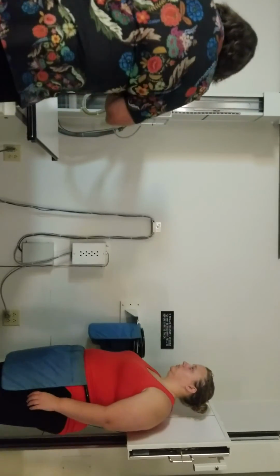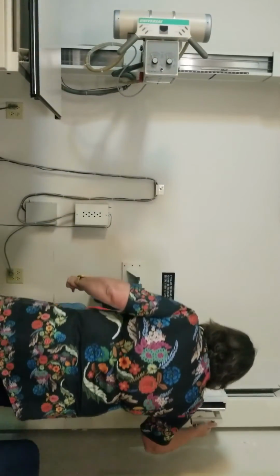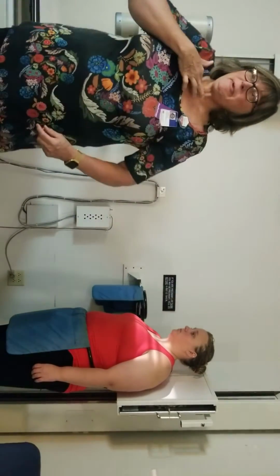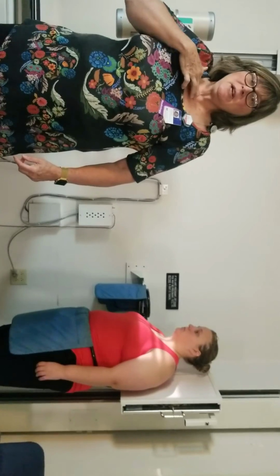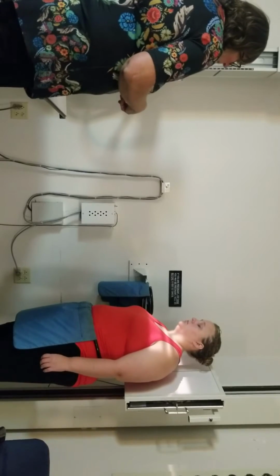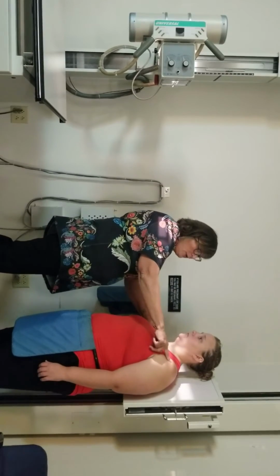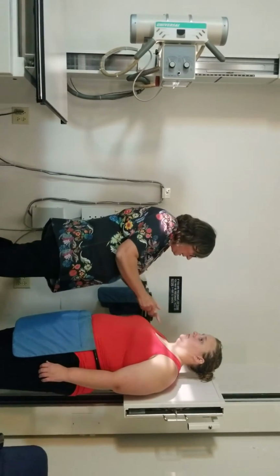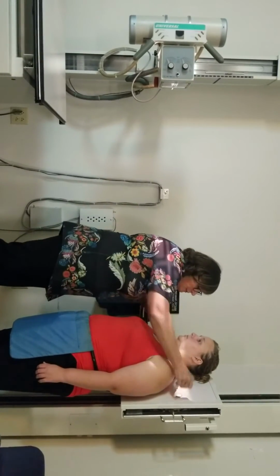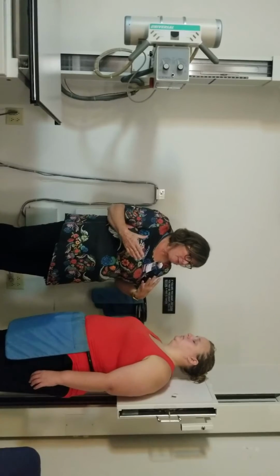So for this first one, I'm going to have Ellen stand with a neutral position. I'm going to center 1 inch above her jugular notch. Remember we found jugular notch when we did the AP chest? So 1 inch, which is about 2 fingers above. And when I do that, my crosshairs should be going right through her AC joint. Does that make sense? So that's kind of how I gauge that. So left, and I put my right there. That's a good one. So when you do bilateral, you want to put both markers on, left and right.